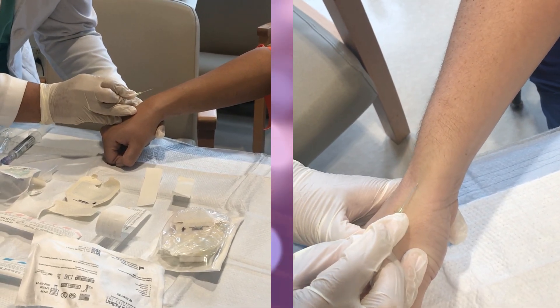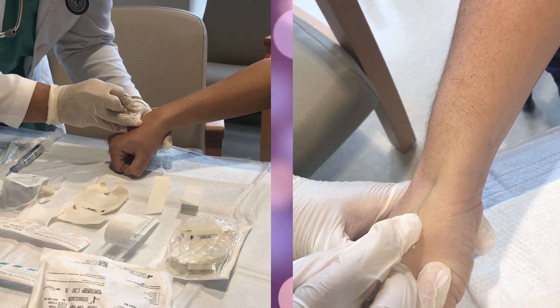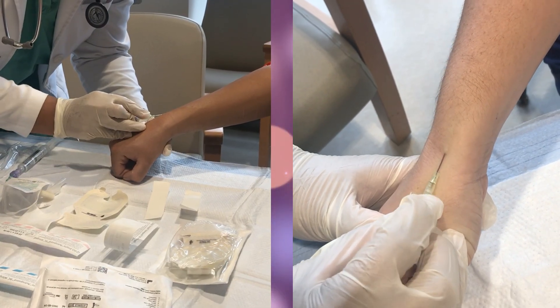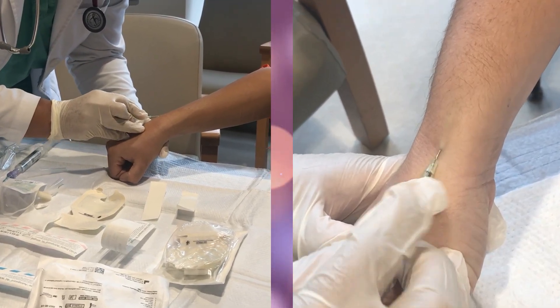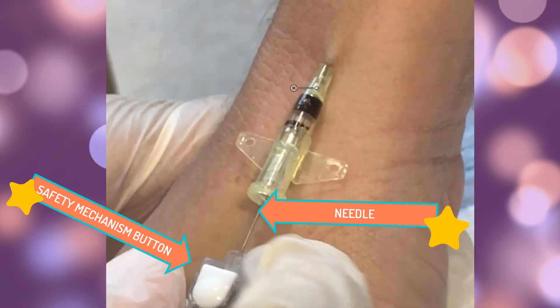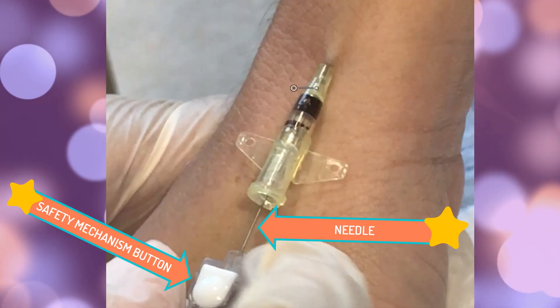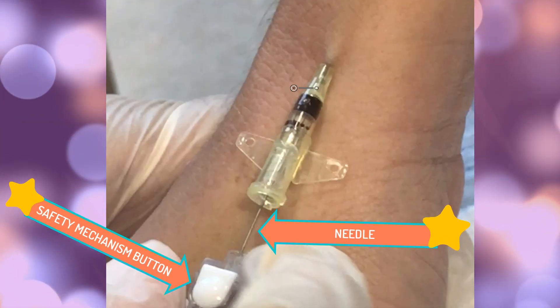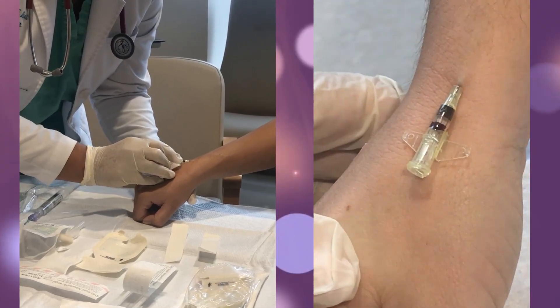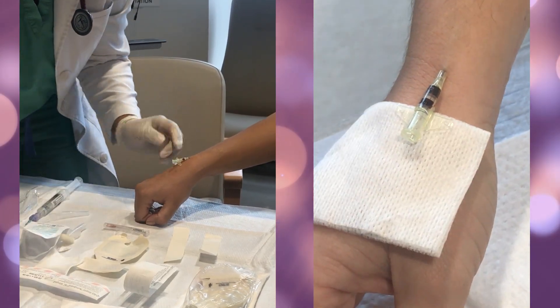Once you have chosen the correct size of catheter, stabilize the limb and insert the IV at about a 30-degree angle. The flashback of blood in the catheter applicator will indicate that the vein has been hit. Advance the needle one more centimeter into the vein — you can see the needle, that little silvery thing. I then press the safety mechanism — that white little button — which retracts the needle inside, protecting me from getting stuck.